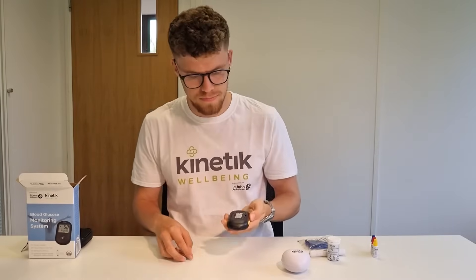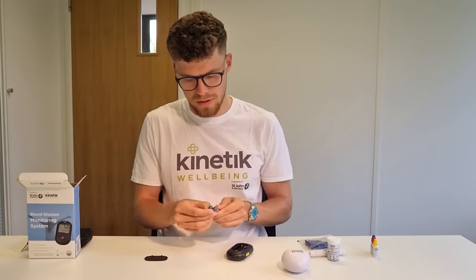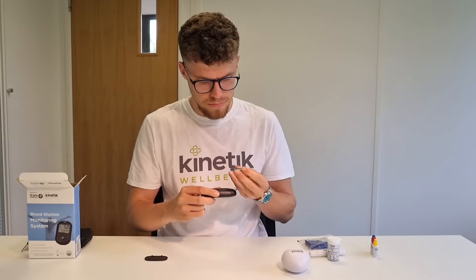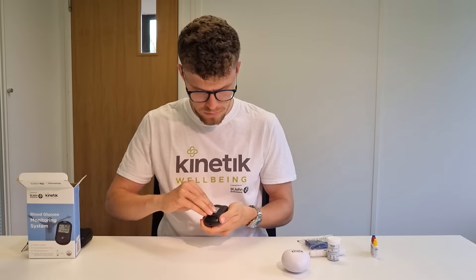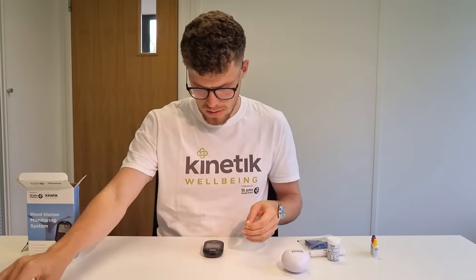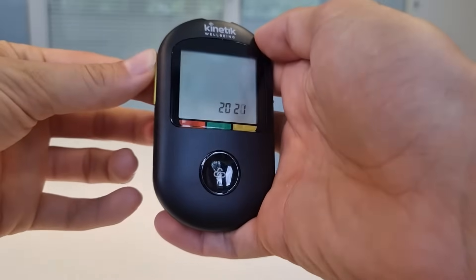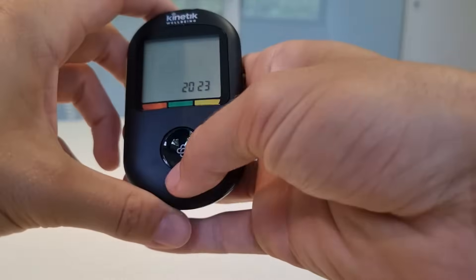First of all let's insert the batteries — simply prise open the battery compartment, take the plastic film off the batteries, and insert them making sure they're the correct way around. There is also a screen protector you can peel off. Once you've inserted the batteries you'll get the option to change the date and the time. Just use these buttons on the side to adjust, with the up arrow going up and the down arrow going down, then hit the middle button to confirm.